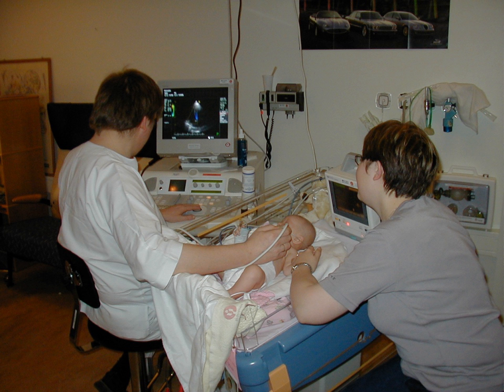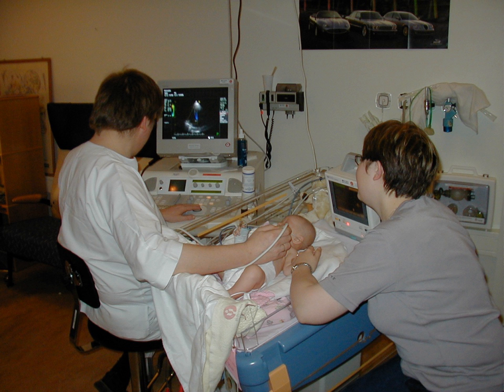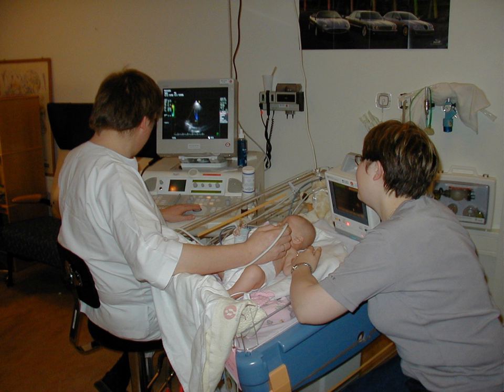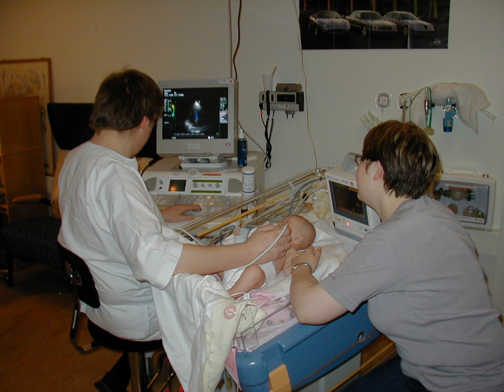The return of the sound wave to the transducer results in the same process as sending the sound wave, except in reverse. The returned sound wave vibrates the transducer, and the transducer turns the vibrations into electrical pulses that travel to the ultrasonic scanner where they are processed and transformed into a digital image.